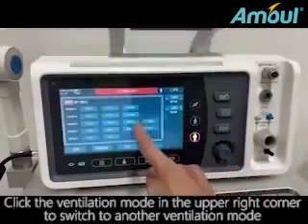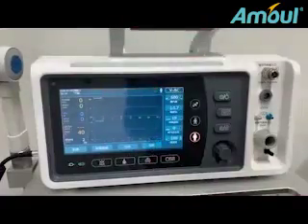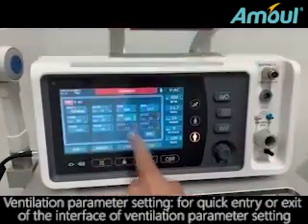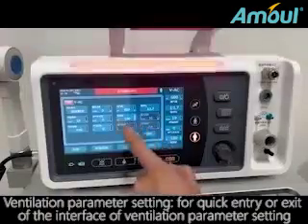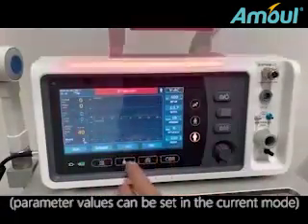Click the ventilation mode in the upper right corner to switch to another ventilation mode. Ventilation parameter setting: for quick entry or exit of the interface of ventilation parameter setting. Parameter values can be set in the current mode.